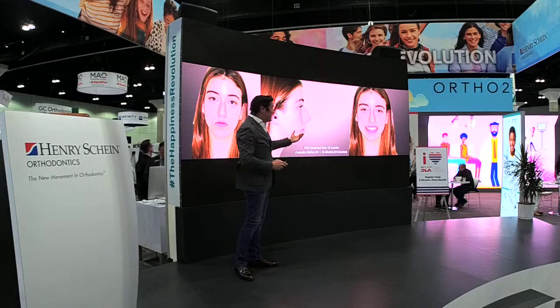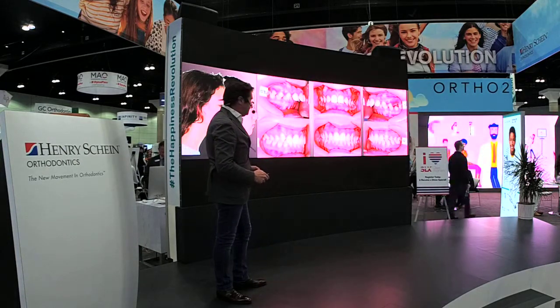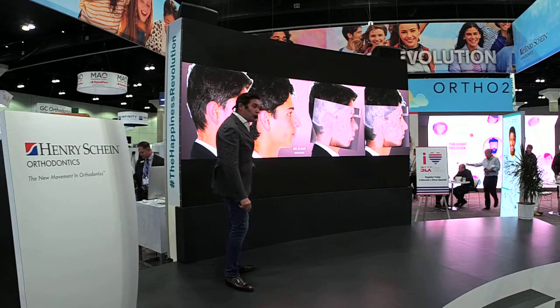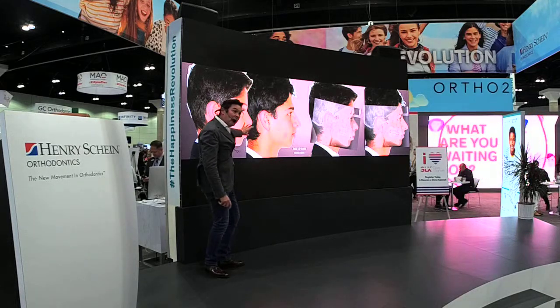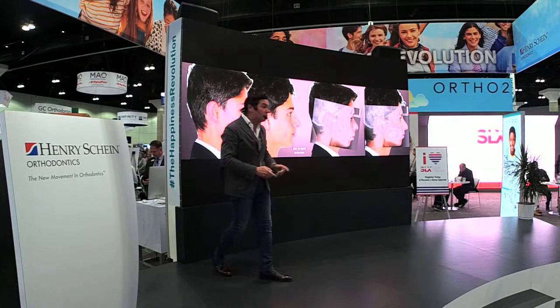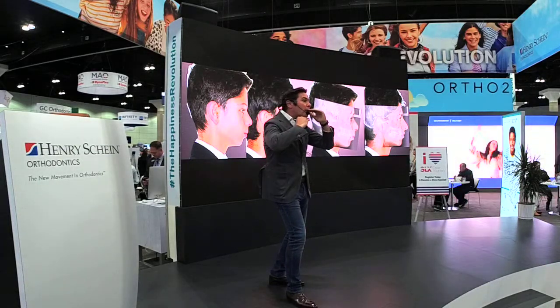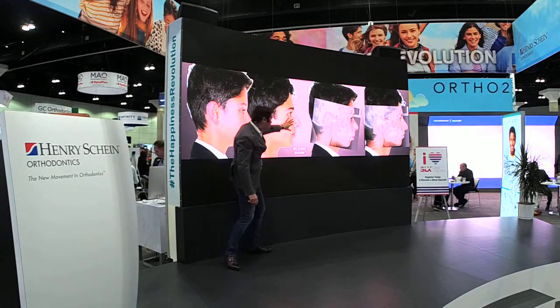In this scenario, here is the girl finished in a good relation. With this mandible retrusion, and with this length of the upper lip, when we have an upper lip that is long, there is not a balanced profile, because remember, Leonardo da Vinci was giving us a proportion that the upper lip has to be 1/3 in relation to the lower lip and the menton. So this is too long and this is too short, and we want to shorten that.